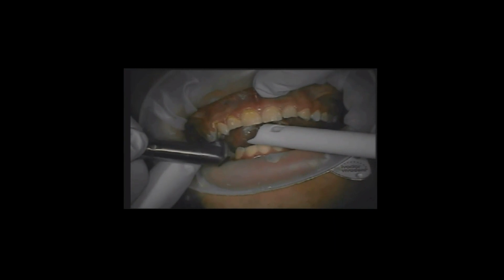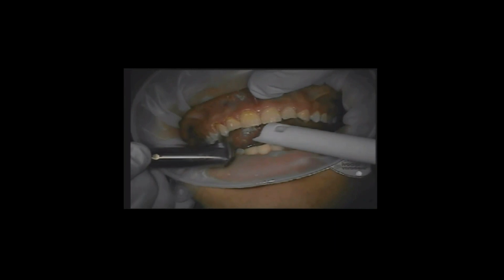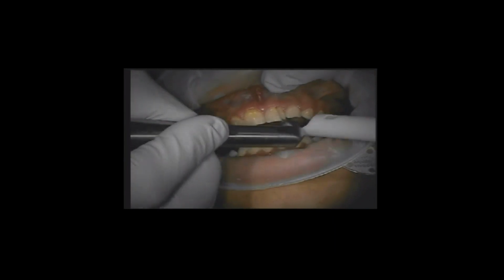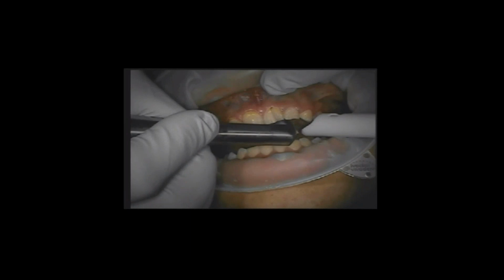And as you do this dry, you will notice almost a cotton candy, I like to call it, appearance of the tissue that gets on the end and gets on the tissue. What works really nice too is you can see the high back suction has the little extra hole in it, and I make sure the assistant has that towards me, because then I can use that to gently wipe any buildup off of the tip as I move along and do this.